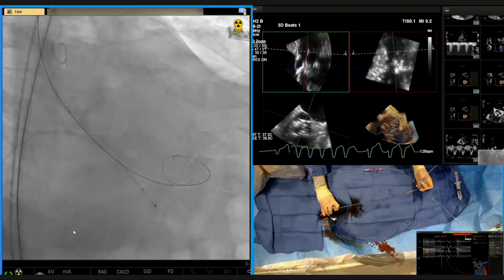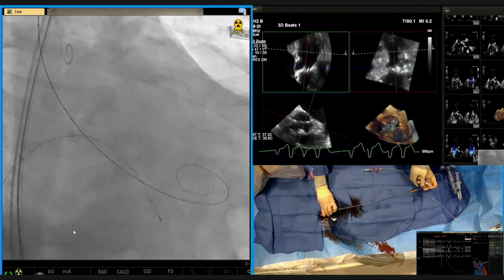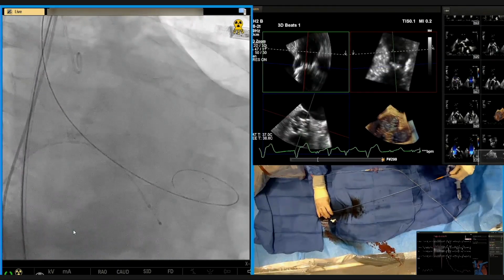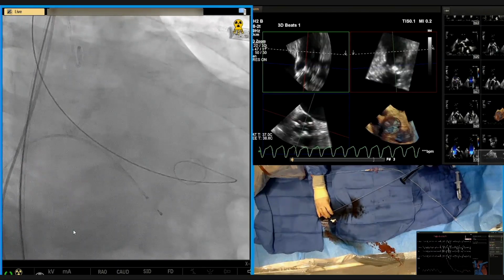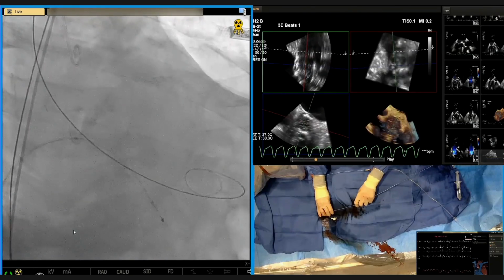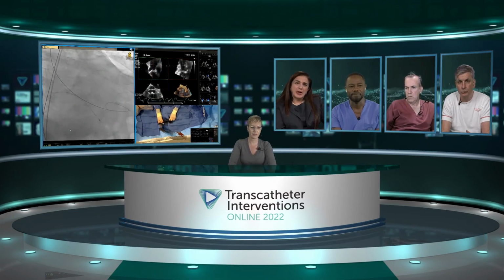So I think a 26 should be okay based on that. What does the panel think? The 25 balloon, that looks like a good size valve. You sealed adequately with a 25 balloon and a good injection. So I think that your assessment is correct. We're going to leave you for a minute. You guys keep working, and we're going to head to Erasmus because they're ready to implant their valve. Perfect. Okay, we'll be back in a second.